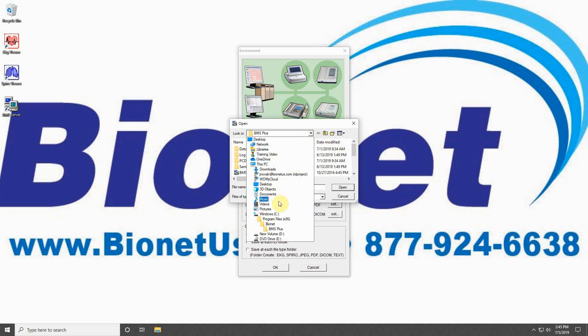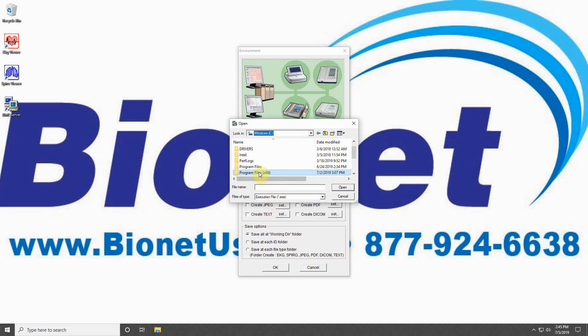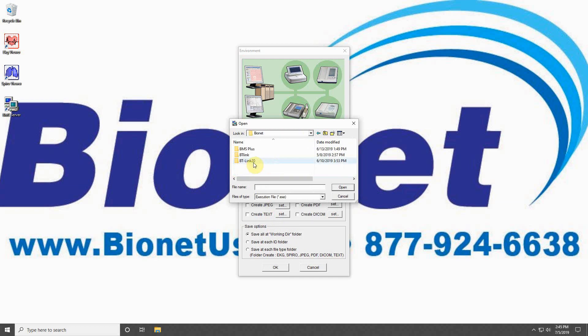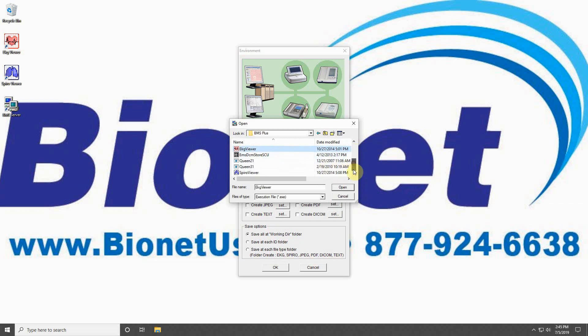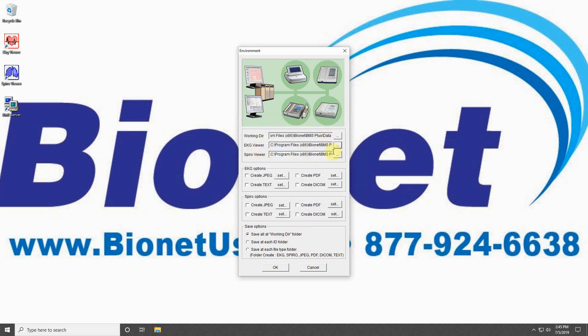Generally, the program files will be found in C, Program Files, Bionet, BMS Plus, and then under the file name EKGviewer.exe and Spiroviewer.exe. Double-click the file to set the location in your BMS Server program.